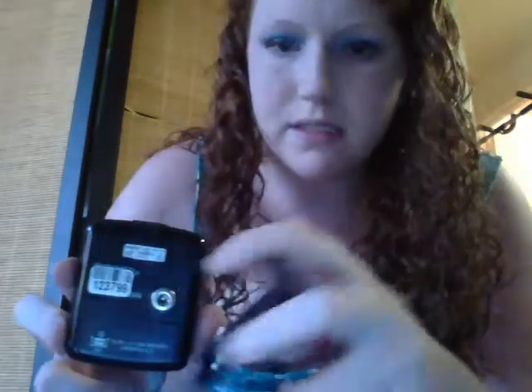Anyhow, I put my LifeWatch monitor in a holder device, because they gave me this little clip, right? It's where you clip it on your shirt or your pocket. It doesn't stay. You're supposed to put the stick in the hole, and it doesn't even really stick in there right. So I just put it in the holder device, and it's been good. When I've had issues with going unconscious, it's easy to see the record button, and it's easy to have it right there on my neck.